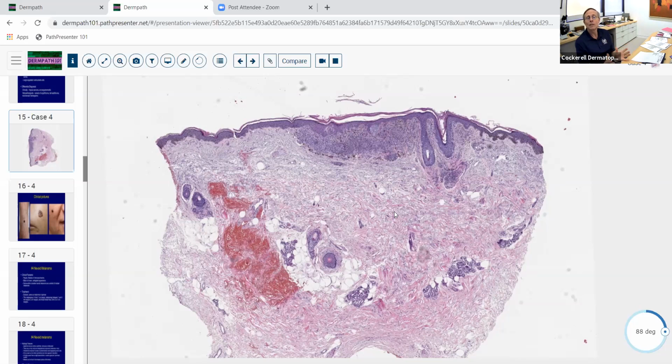If they put a melanocytic lesion on, it's going to be an obvious dysplastic nevus. They might ask about the dysplastic nevus syndrome. They could put an obvious Spitz nevus and maybe ask you about the setting where that might occur most commonly. They're going to put an obvious malignant melanoma on there to make sure that you're not a dangerous doctor, that you're going to be able to recognize it. But they're not going to put a lesion like this on. I'm going to show it to you because it's important that you understand where the limitations are sometimes in what we do under the microscope.